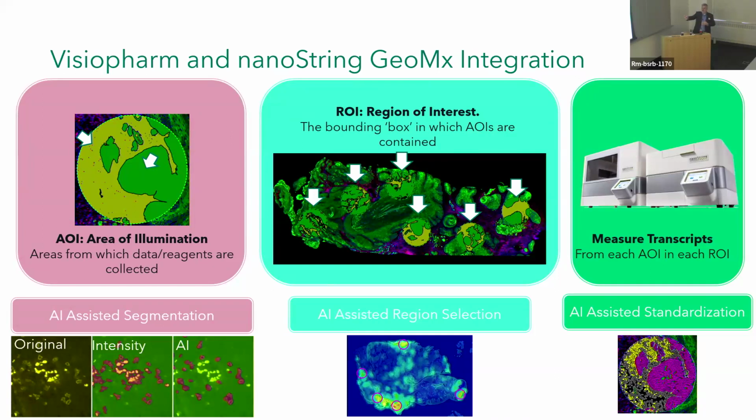It's also available to be able to help identify where those regions are best suited. The example in the bottom middle here is looking at hypoxic areas of a tissue, which is really hard to see visually. But if we can identify hypoxic areas of the tissue, then we can help identify areas where running the genomics instrument might be best suited. This is also useful if you're doing things like making TMAs and you want to know how to punch TMAs. This might be a useful technology there.